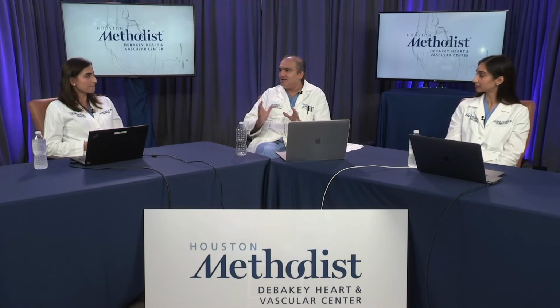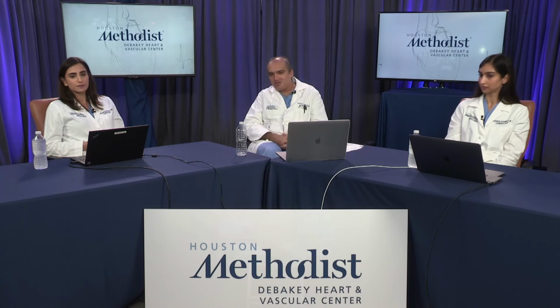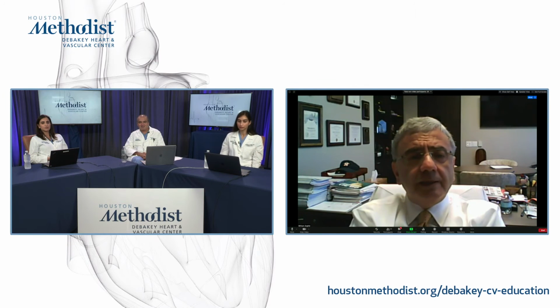that you have, and in each scenario applying which is going to be the best test for the particular scenario. I think Bill, do you have a question also? Or comment? No, I think that's a very important question. I think timely in the COVID era, and there will be some recommendations coming out hopefully in the next few weeks. But I think, Shaden, you got it right.